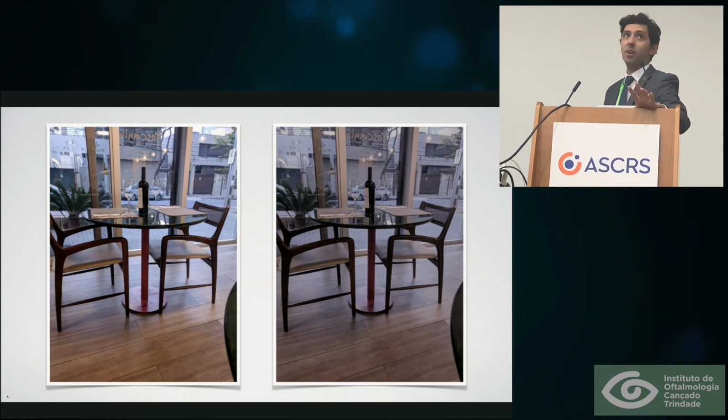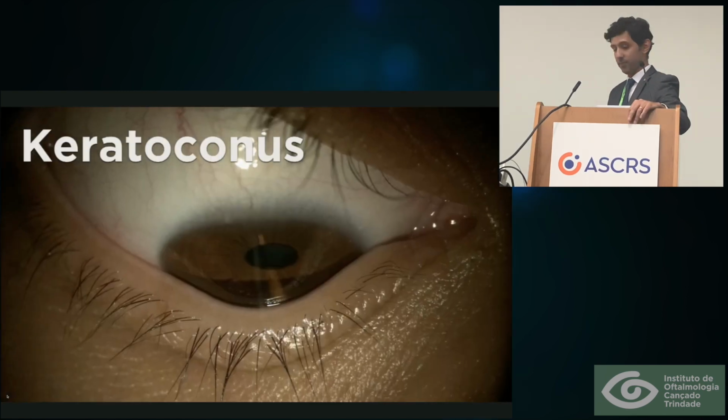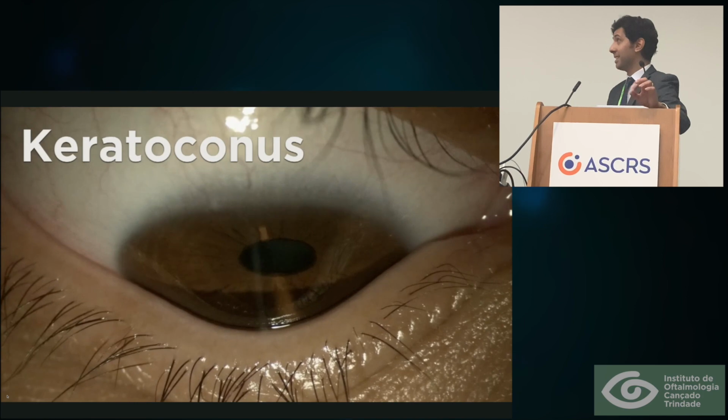She said that outside in sunshine, she couldn't really tell the difference between normal and how she feels now. But this is what she says, that before surgery, she would feel something like this. And after surgery, she could see a small reduction of luminance, or a small darkening sensation, which she believes was totally outweighed by the benefit of the visual improvement. So again, this is an excellent solution to consider in face of keratoconus.